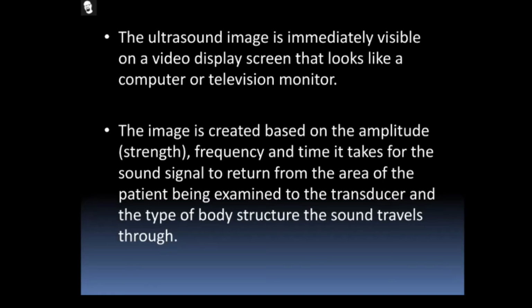According to the database, the frequency is automatically adjusted. Nowadays, with recent ultrasound machines, the doctors are not supposed to fix the frequency at all. Automatically, from the database, the patient name, the patient age, the area we need to scan, whether from the abdominal region or through the backbone side, all the things we entered, the machine itself learns everything, and according to that, the frequency is set automatically. The frequency is set automatically, sent into the internal organ, and the signal is received.